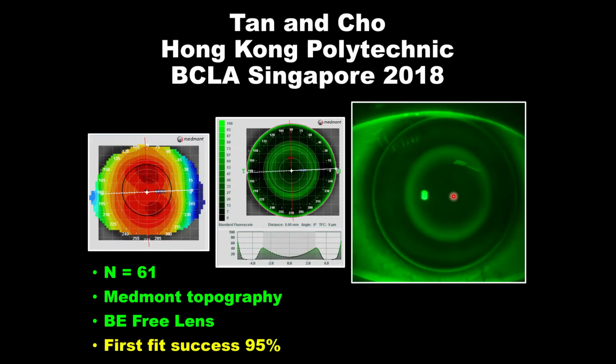Now, if you didn't have a composite, does it really matter? If you had a patient that was very fidgety behind the instrument, or a patient with a very dark iris, and we're not able to get a really good composite capture, then can we build the lens from one single map? And the story is yes.